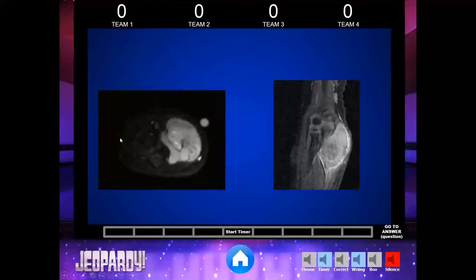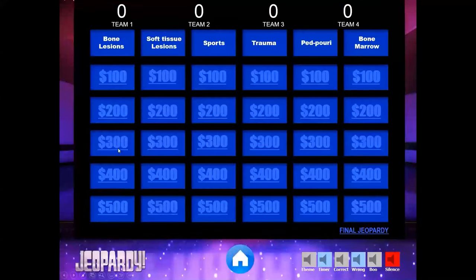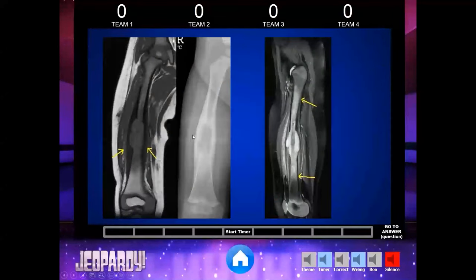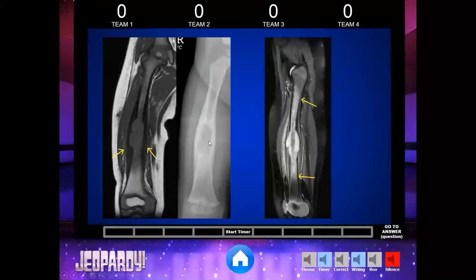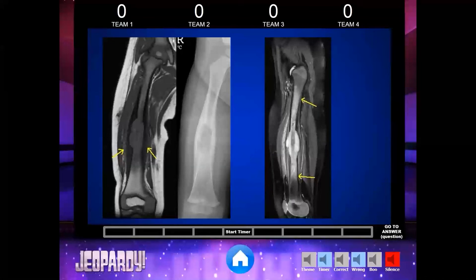Let's go to the LCH case. LCH is a very cool entity — it's a fooler for sure. It's a lesion that on X-ray has a punched-out lytic lesion look, and that's what we're seeing here. On MR, it can even have a soft tissue mass and look very aggressive. But when you put it all together, if you have a lesion with massive edema around it, it should make you think something inflammatory or infectious — LCH is kind of an inflammatory lesion.